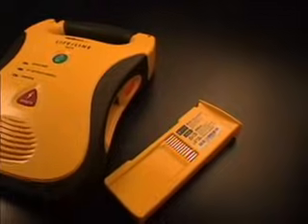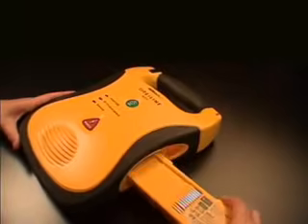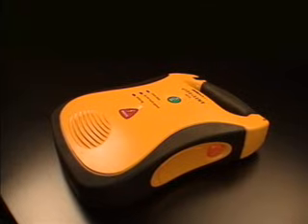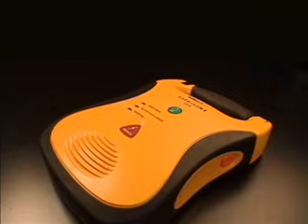The Lifeline AED is powered by a long-life replaceable lithium battery pack. Insert the battery pack into the Lifeline AED by pushing it into the battery compartment, label side up, until it clicks into place. If the battery pack is inserted upside down, a stop will prevent it from going in all the way.